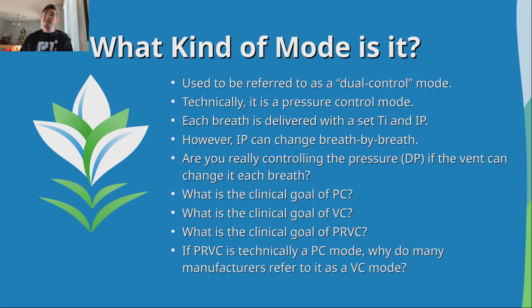Now, what is the clinical goal of PRVC? Why would you put a patient on PRVC? Well, it's a pressure control mode, right? Technically speaking. So would you put them on it to limit their driving pressure? Once again, no, because the vent is changing the driving pressure each breath. You're not controlling that at all. But what are you setting? Well, you're setting tidal volume. So really, if you think about it, the goal is very similar to the goal of volume control. You are trying to get a stable minute ventilation.